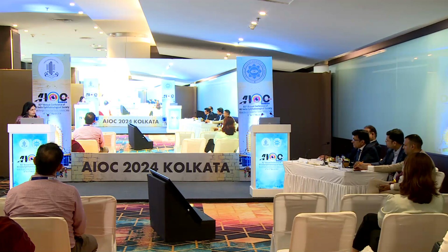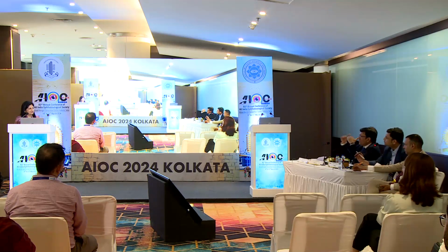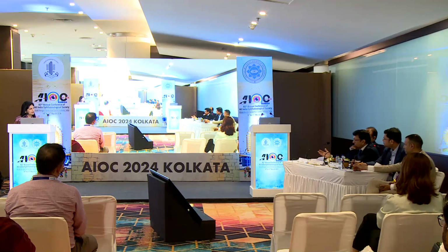And when you looked at the OCT, did you look at the cross-sectional image or B-scan image or the en face image? Sir, cross-sectional image. Because when you have Drusen on a cross-sectional, the difference between two lines is 300 microns, is 0.3. So you might miss Drusen in the middle. Yes, sir. You may say you take an HD20. So I'm thinking in terms of size, but I don't know. When you do a cross-sectional, can you do seamlessly throughout without missing any area on a cross-section? Yes, sir. It's a line scan.